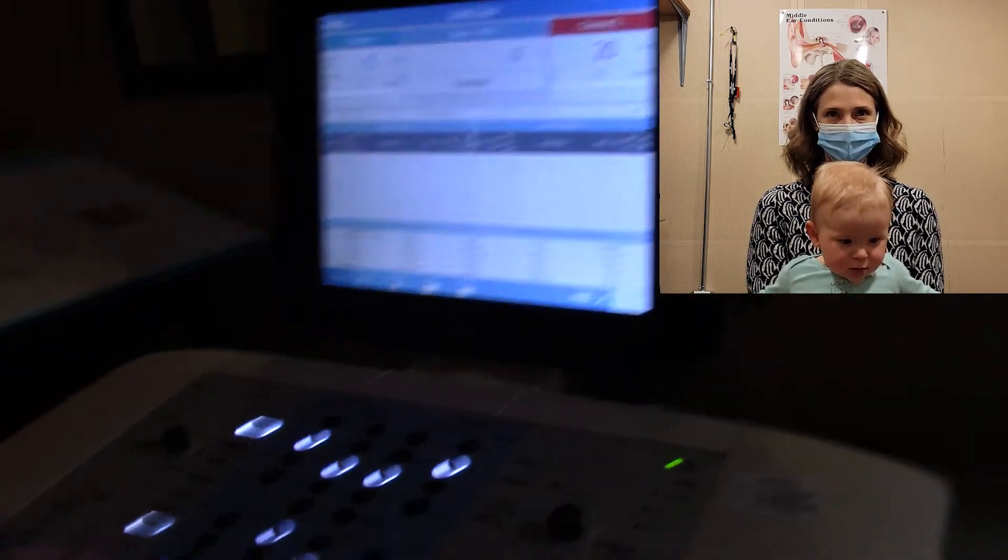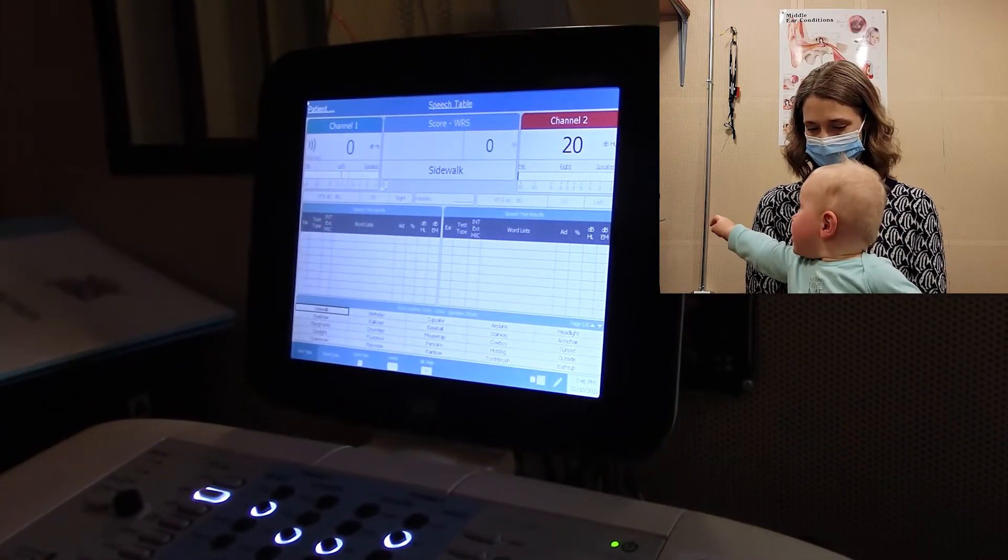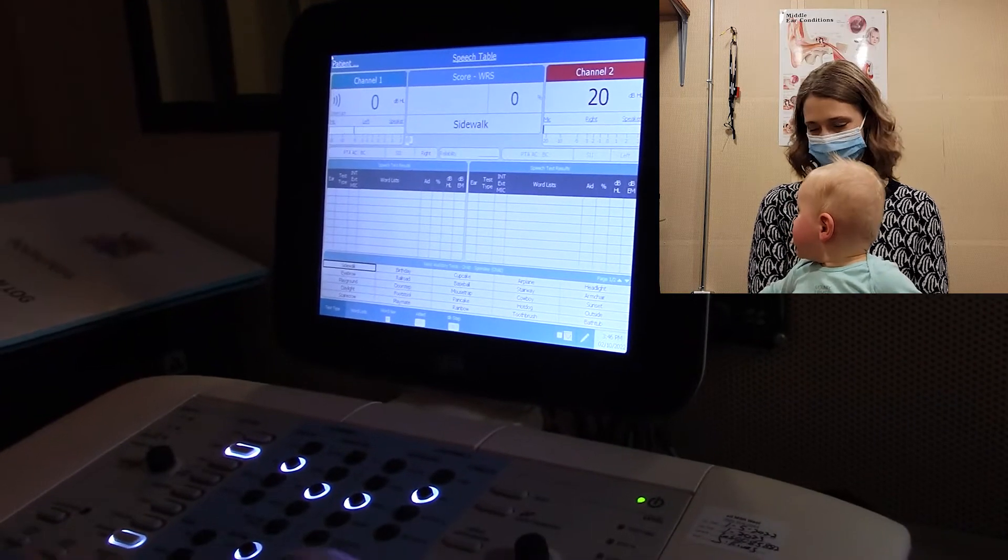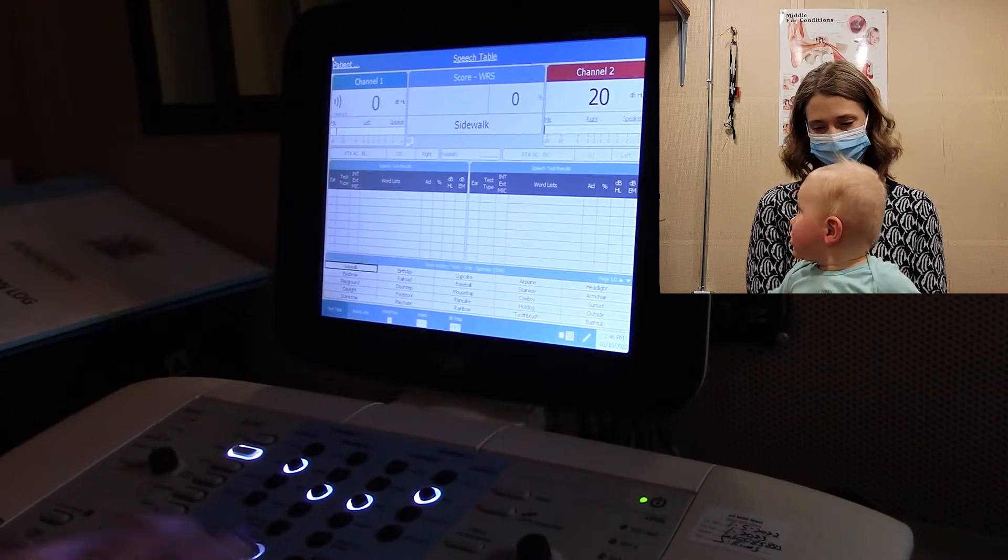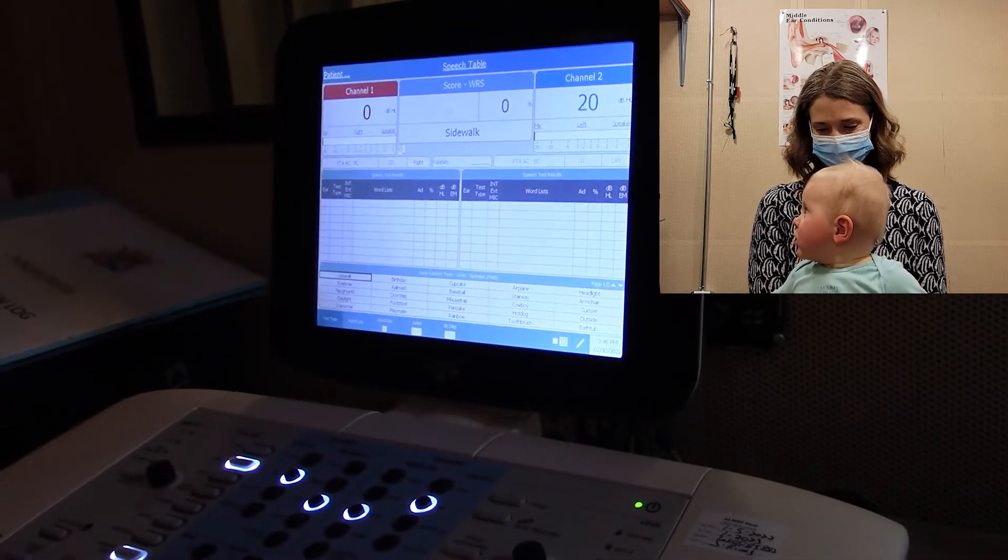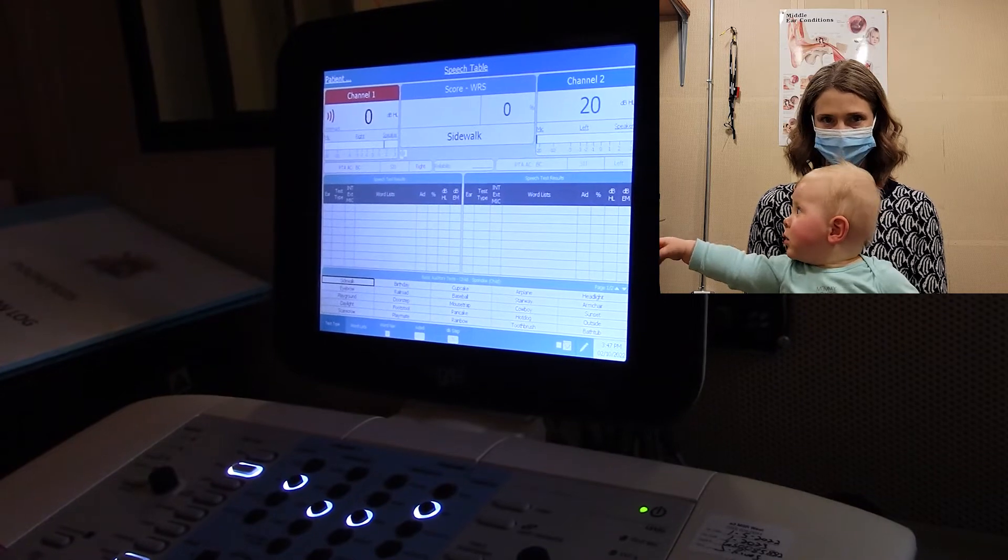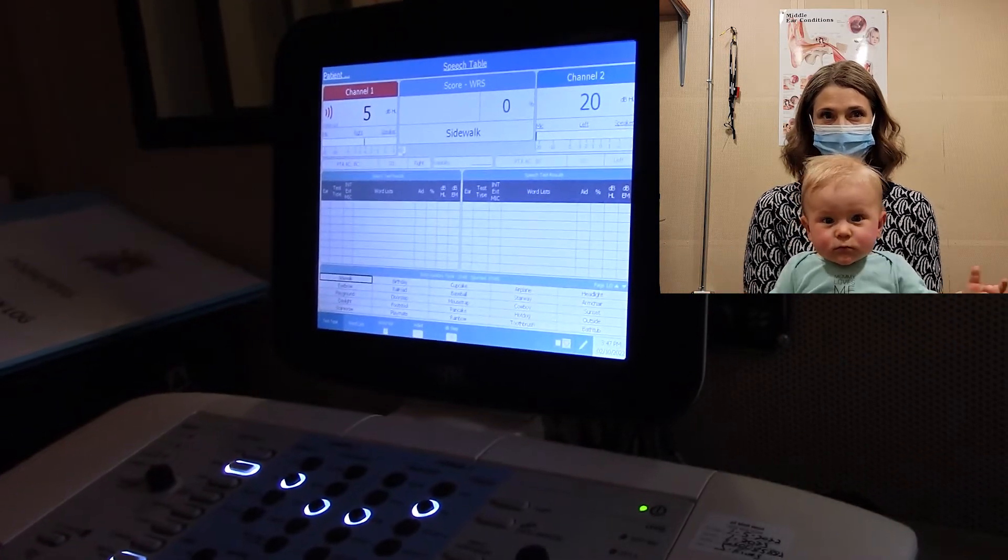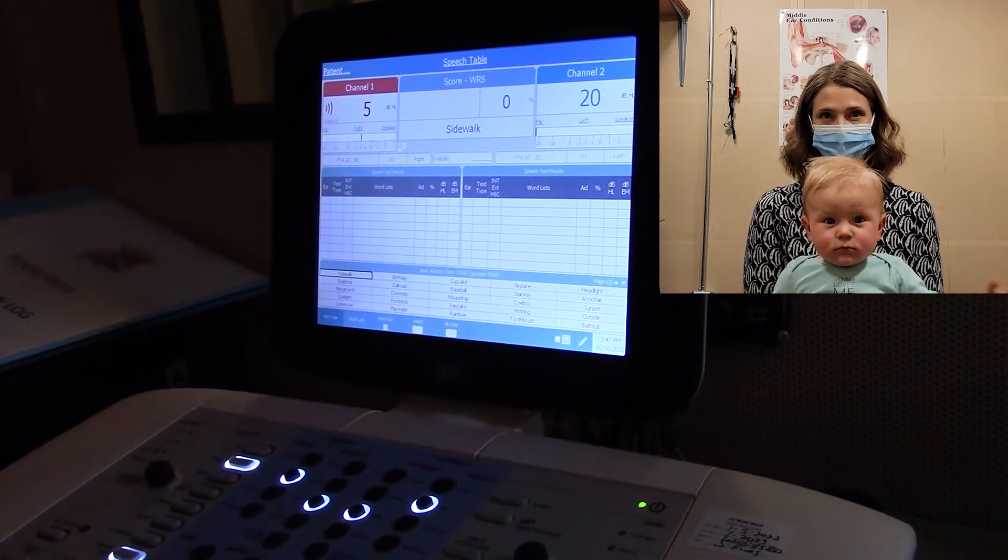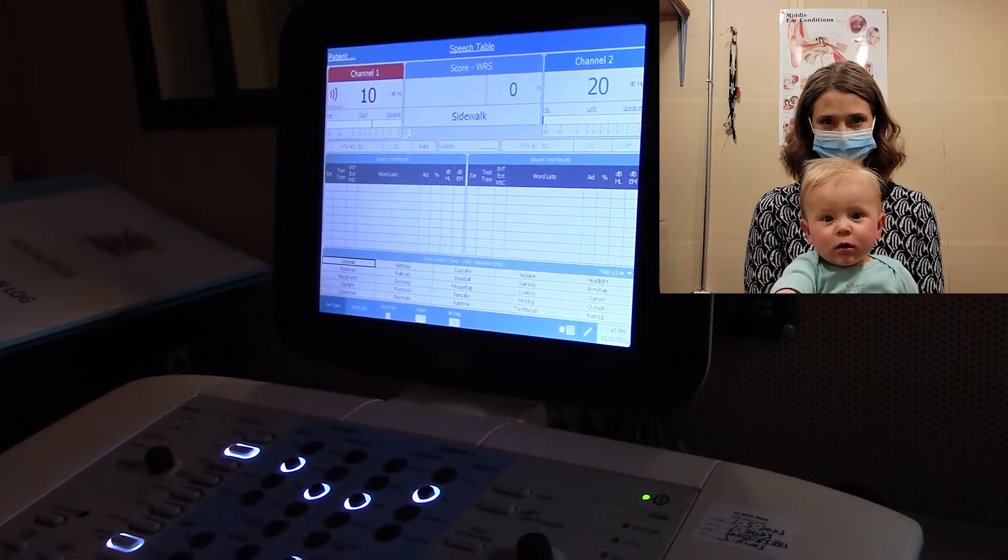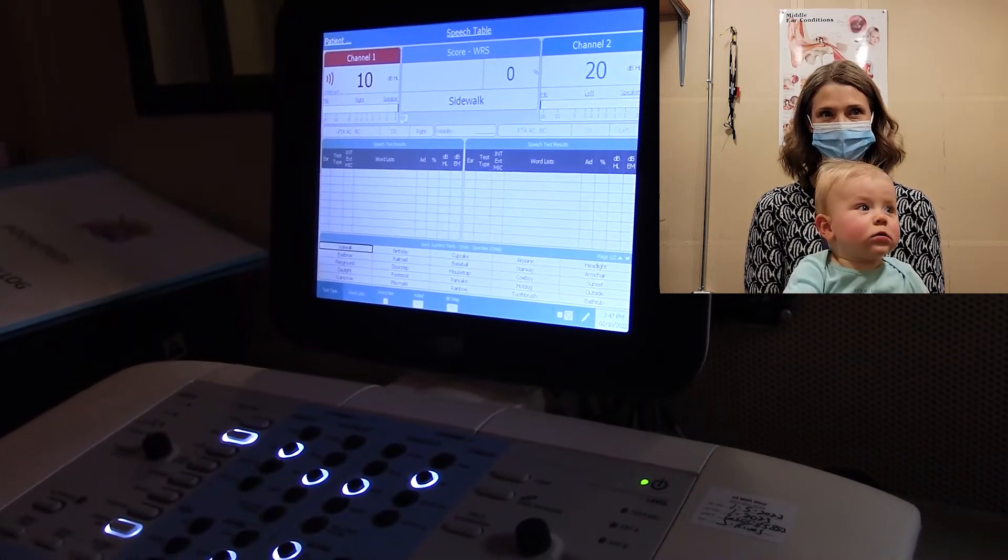I'm going up 5 dB slowly. I'm going to switch to the right because he's looking left or right. What is going on? Hello.